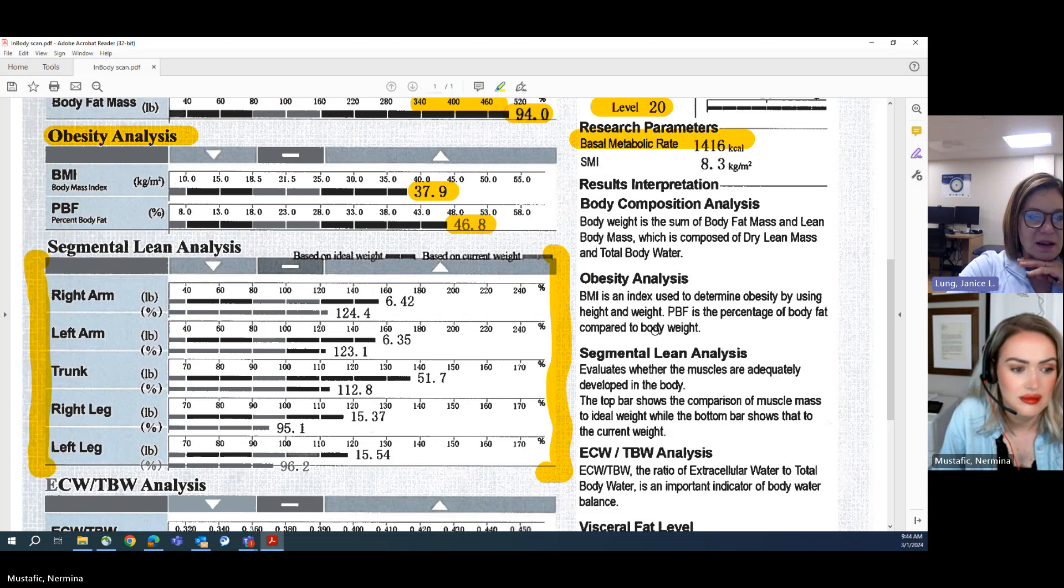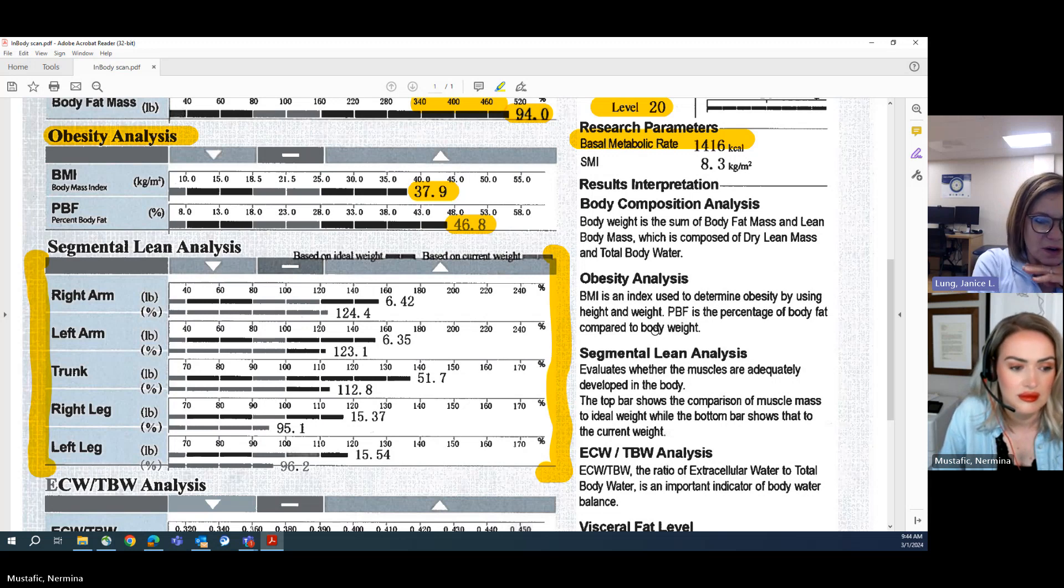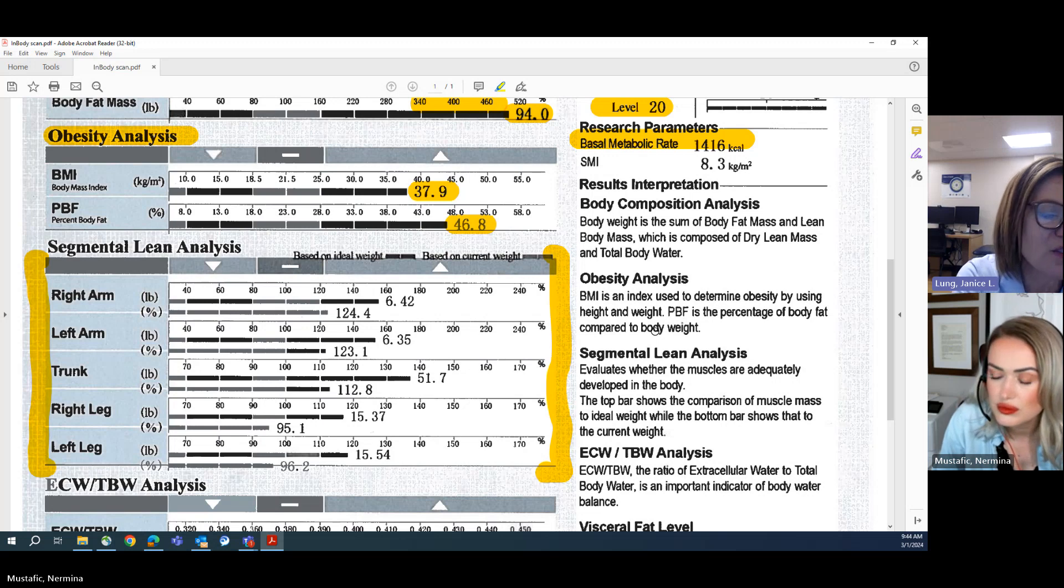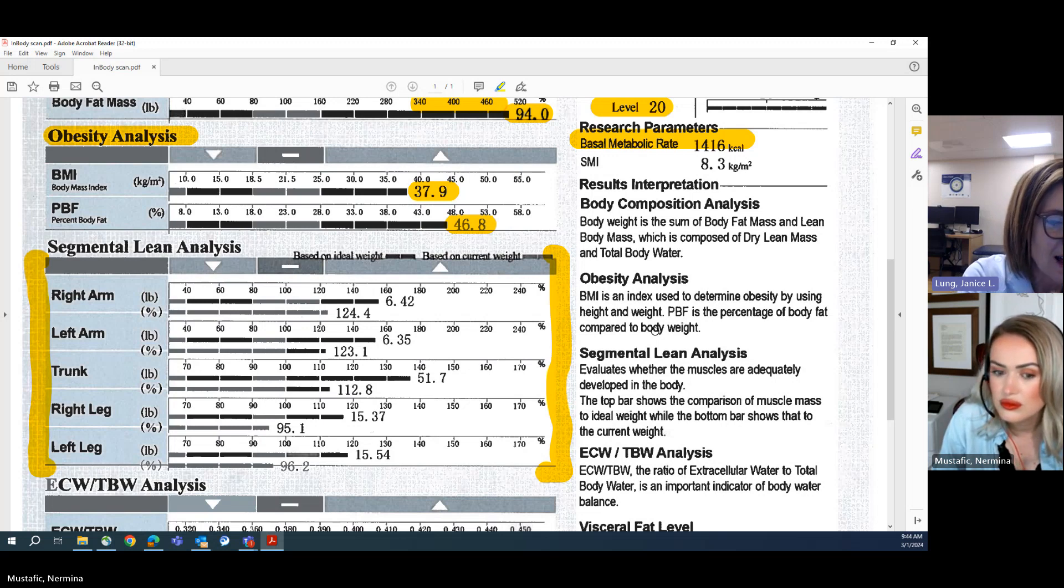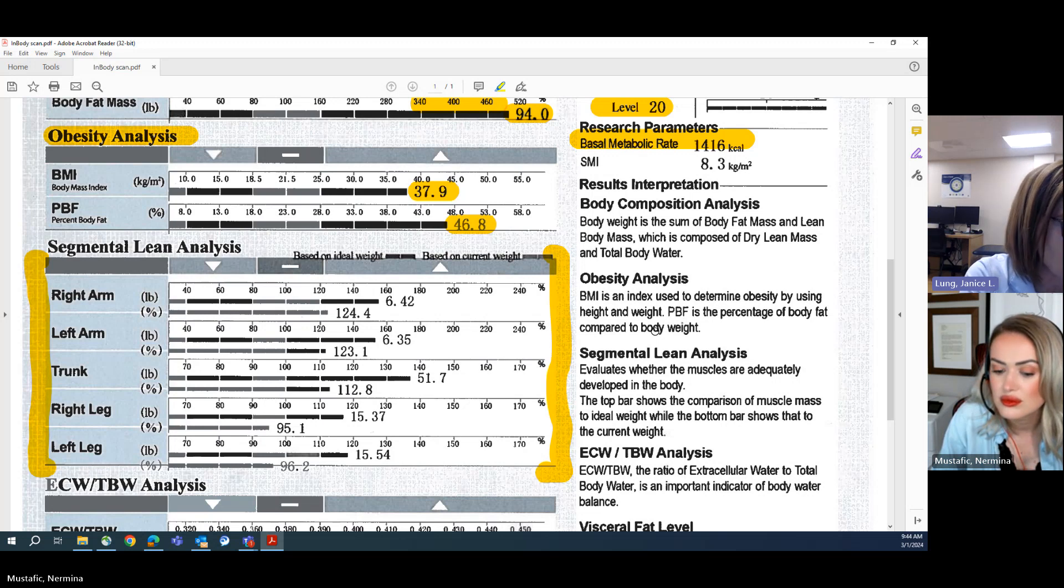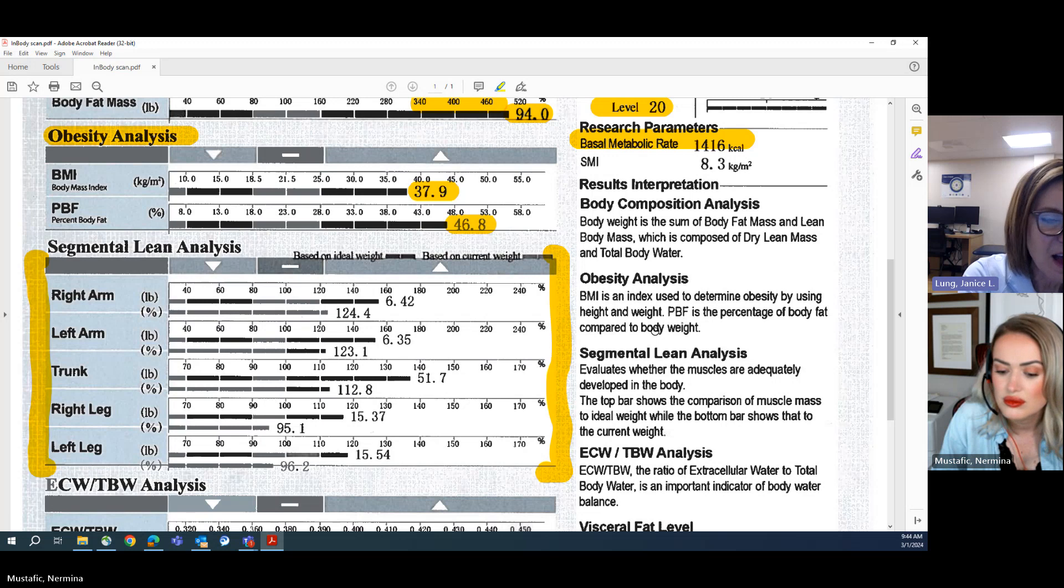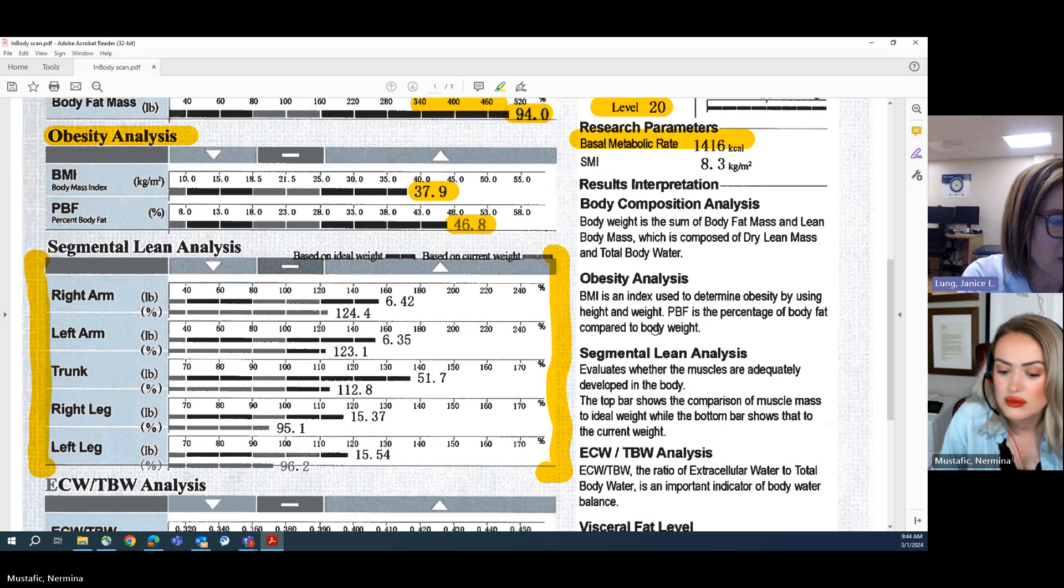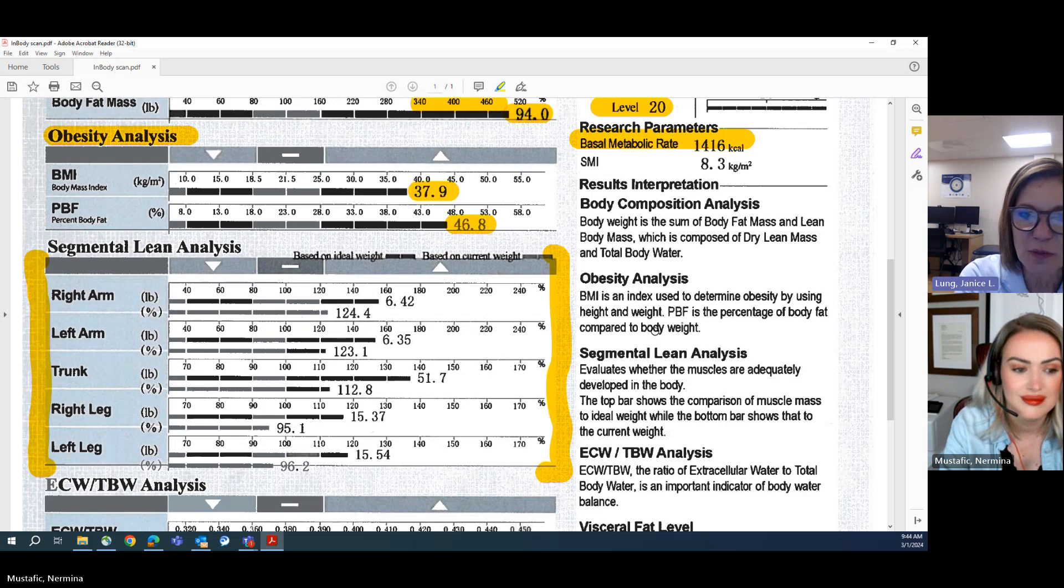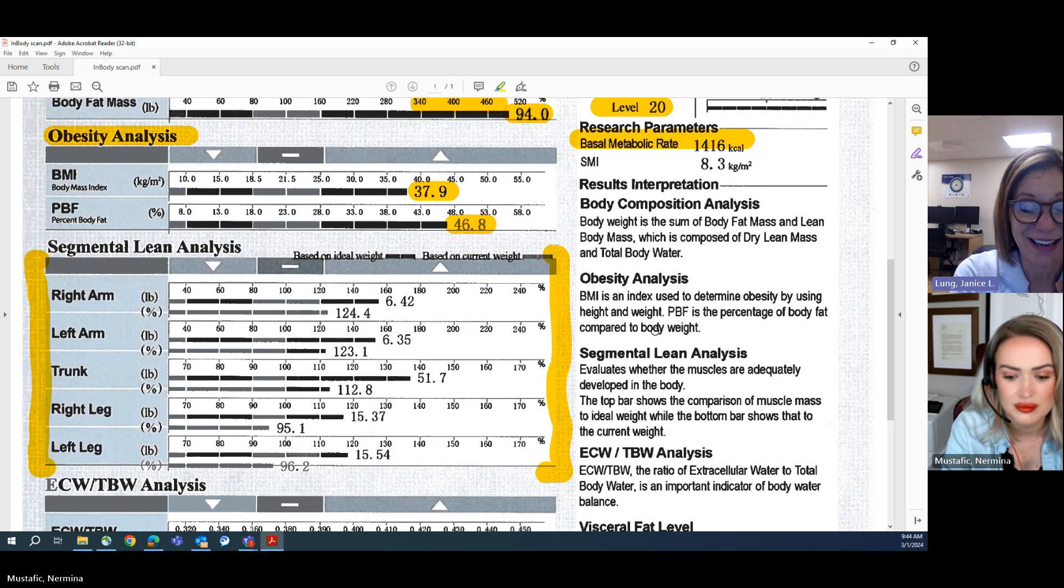I can see this person has a little bit more lean mass in her left leg than she has in her right leg. Perhaps she just somehow kind of favors her right leg. Again, not really that valuable, just kind of interesting to see.